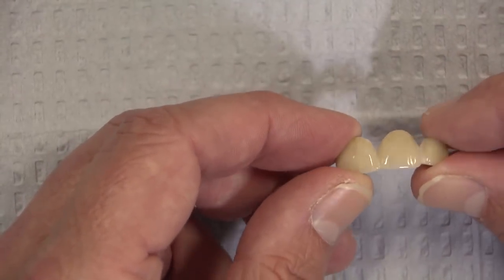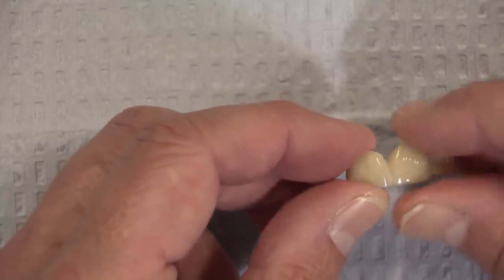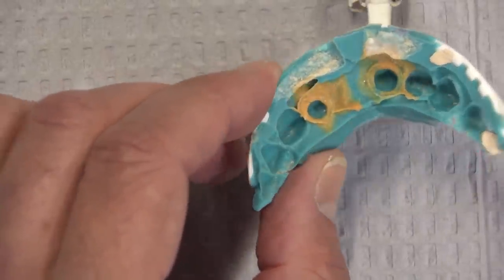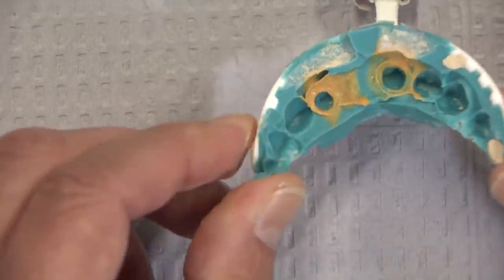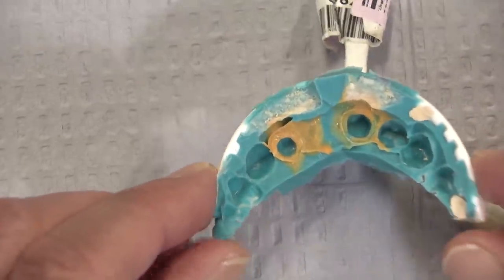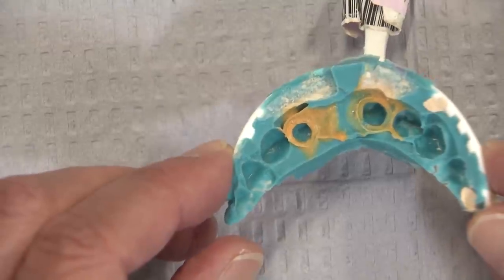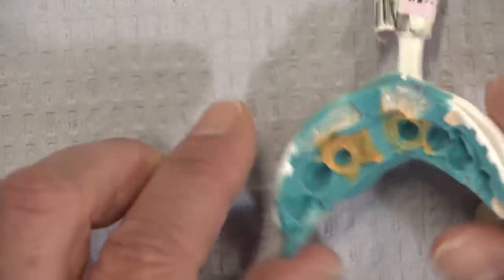This was a bridge that kept coming off — a Bruxer bridge that wouldn't stay on. The dentist has reprepped the case, took a new impression, and sent it back to us. Here's the impression; we can see the margins, which is nice. But we're not big fans of three-unit bridges in plastic double arch trays like this, or even metal double arch trays. That's something we've learned from our own remake rates and from Gordon Christiansen — we do seem to see a lot of bridge remakes, higher than normal, when taken in double arch trays versus a full arch maxillary impression, a full arch mandibular impression, and then a bite registration. So it limits us a little bit in what we can do.